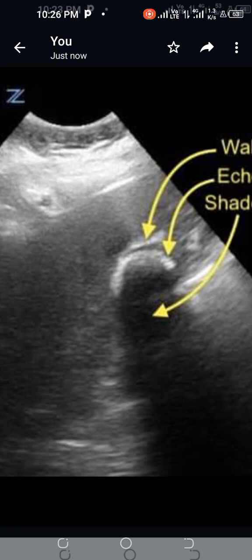This another hyper-echogenic layer represents the near surface of the gallstone. Distal to the surface of the gallstone, there is a casting shadow, also labeled with an arrow. Together, these components form the Wall Echo Shadow sign.